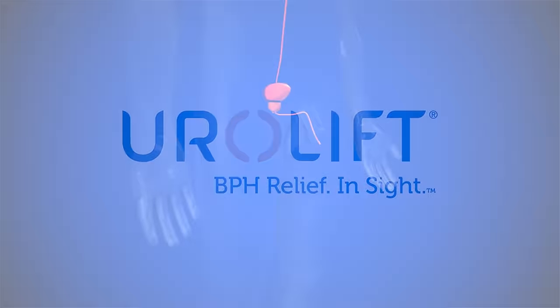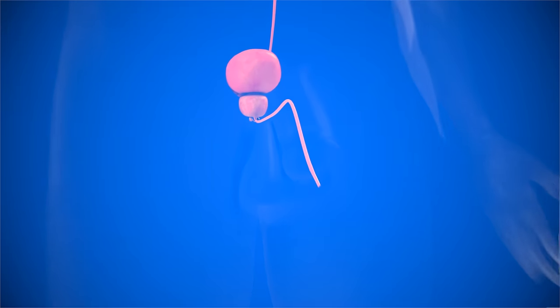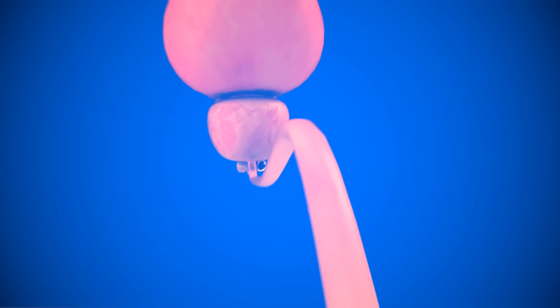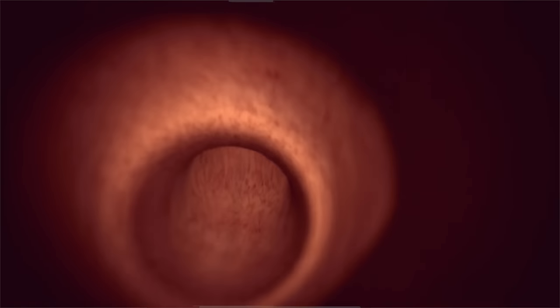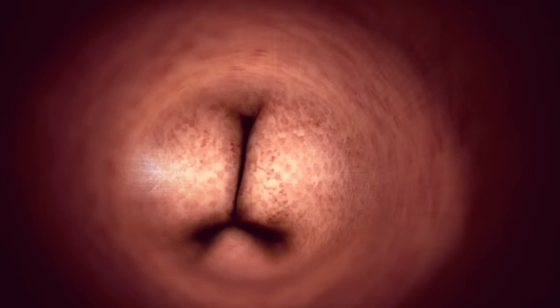The Urolift system is a proven minimally invasive technology designed to relieve urinary symptoms and improve quality of life with minimal side effects for men with an enlarged prostate caused by benign prostatic hyperplasia, or BPH.